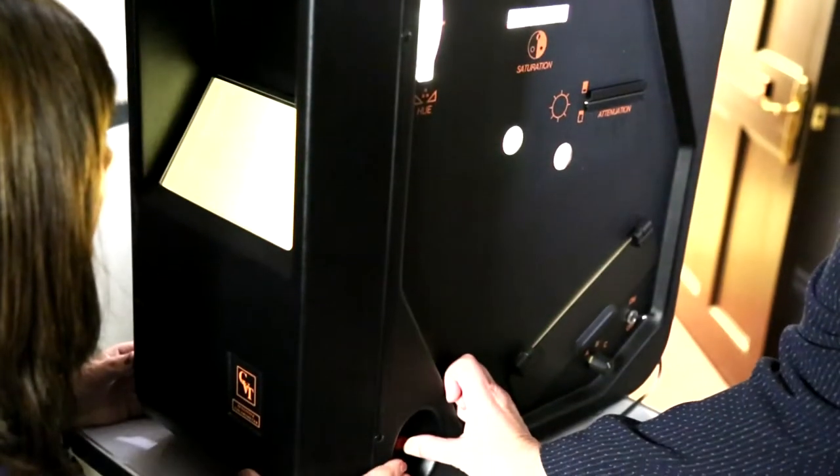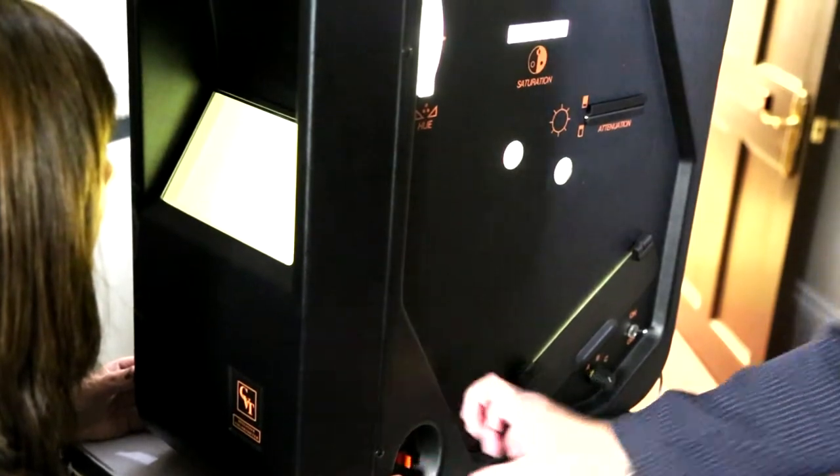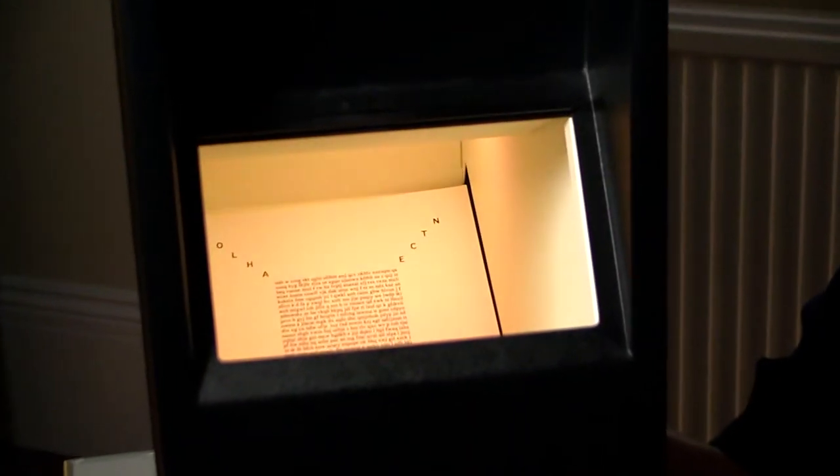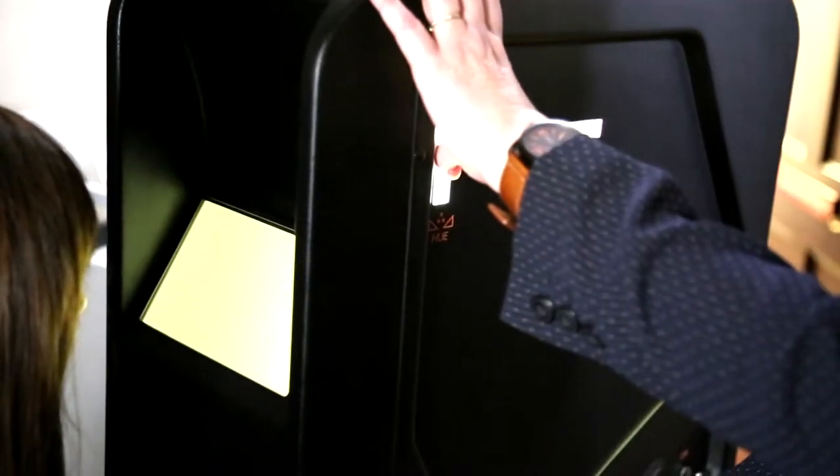This is a colourimeter which assesses people who we think suffer from visual stress. It works by showing them different colours to see if any of those colours will stabilise the print and therefore make their reading experience easier.